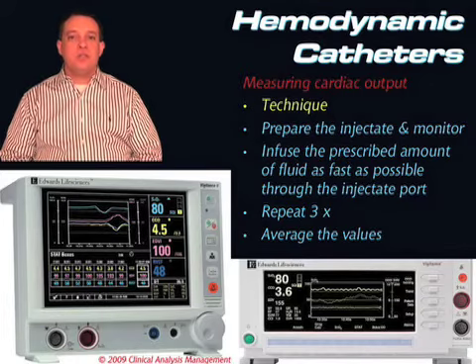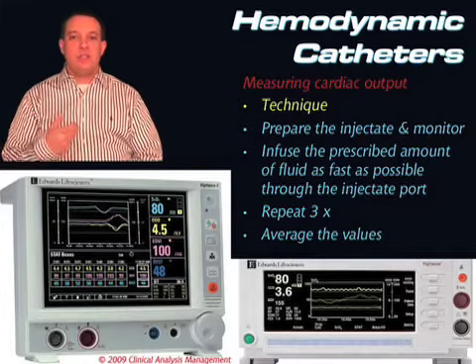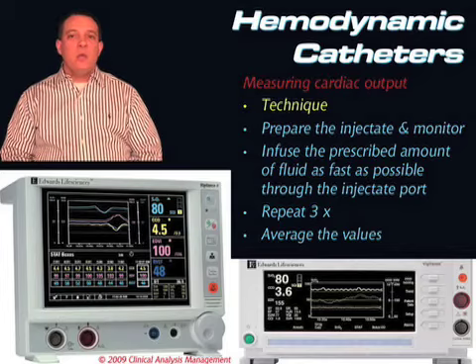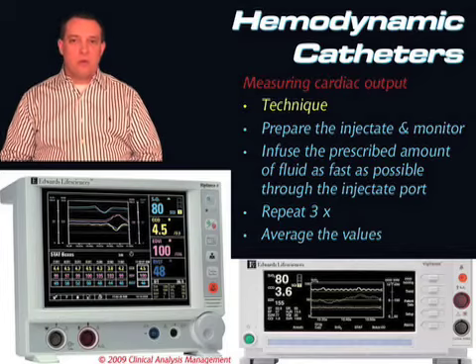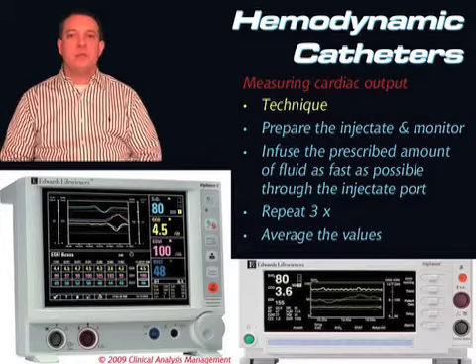It's not like when we push an IV drug. Usually when we're pushing IV drugs, we teach you to push them really, really slowly, nice and gently, over time. When we're shooting a cardiac output, we don't do that. When we're pushing the fluid, we want to push that fluid hard and as fast as we can.